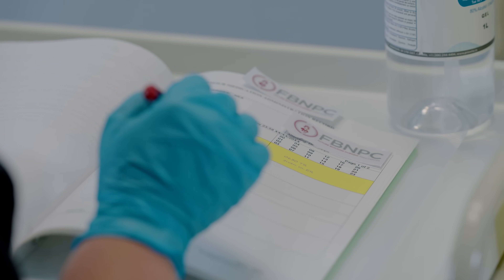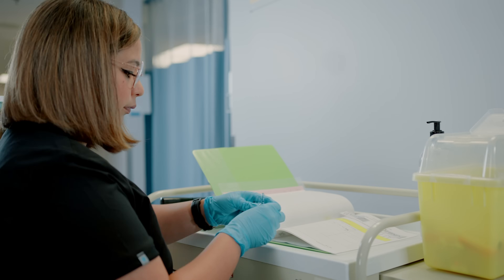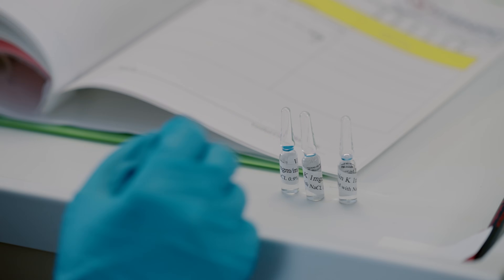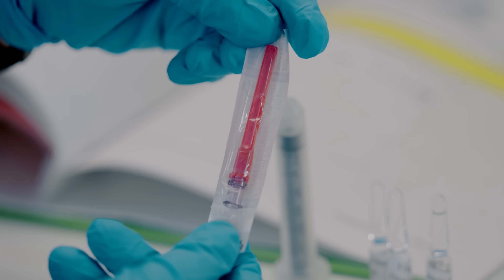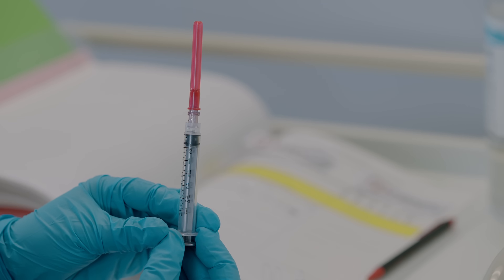The first step in medication administration is to calculate the required volume of medication to administer to your client. So we do our dosage calculation first. In this case we are giving 3 milliliters, so grab your 3 ml syringe. This time, instead of a blunt tip needle, attach a filtered needle. The filtered needle will prevent glass from getting into the syringe and into the patient.